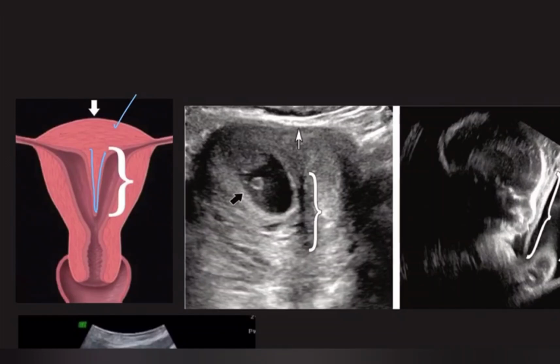Okay, so they will be located in the fundus of the uterus, and they are very symmetric, very thick because of the myometrium. So in this image, we can see the developing G-sac, and here we can see the smooth fundal contour, means it is not a bicornuate uterus, and there is this thick septum. So these septums will be located in the fundal region and grow along the length of the uterus according to the type of the anomaly.